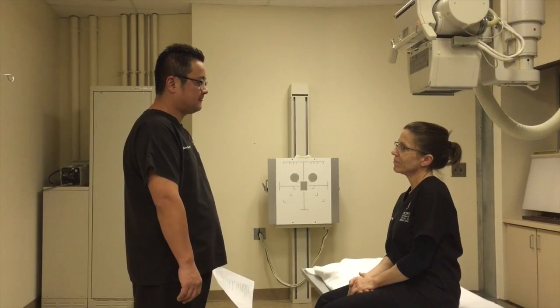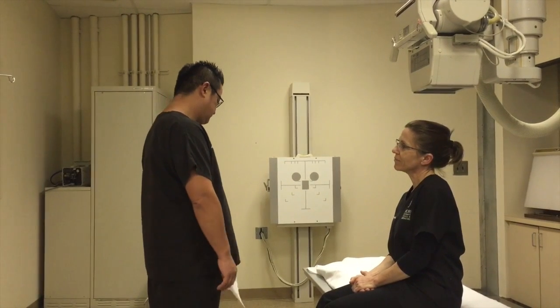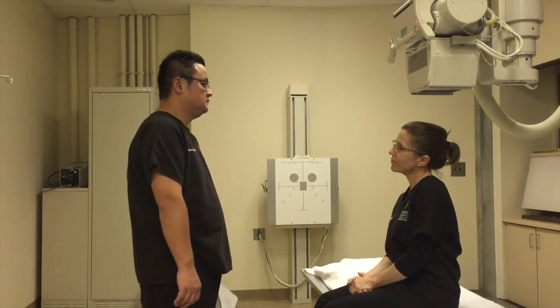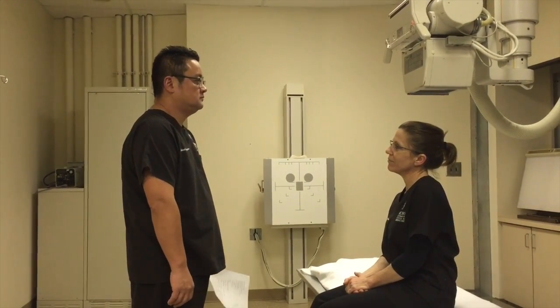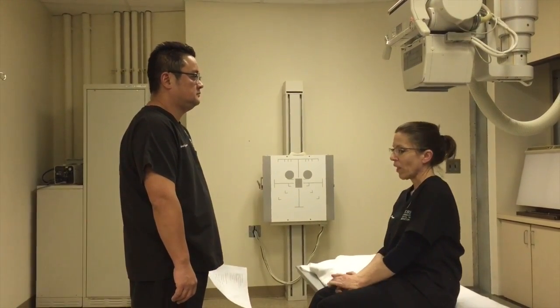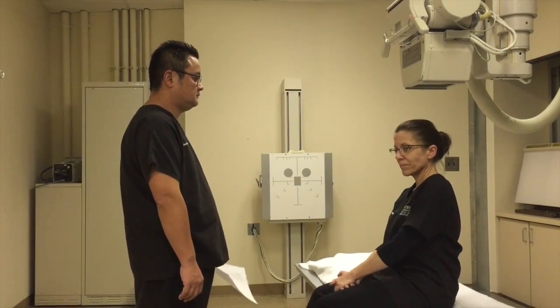This video is demonstrating the patient interview and the role of the technologist during the IVP procedure. Prior to the beginning of the exam, the tech will ask the following to get the patient's history.